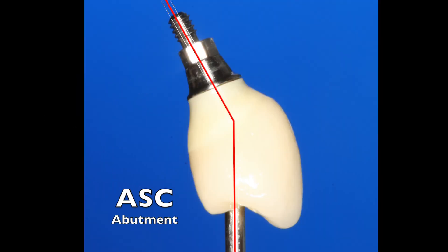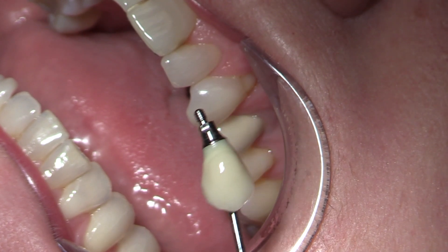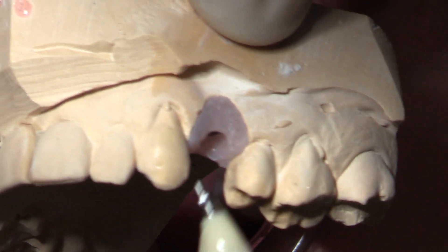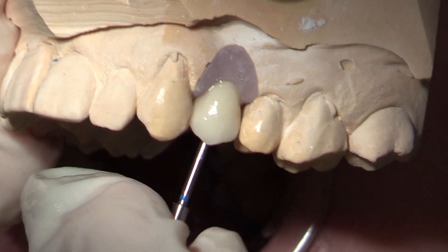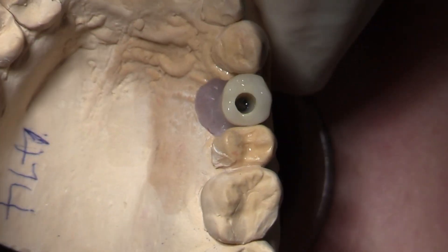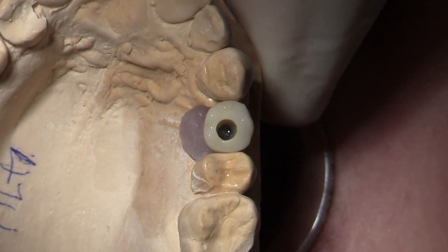After the porcelain is applied to the abutment, you can see the angulation we're able to achieve, allowing us to be screw-retained. We've also tipped it mesio-distally to create the ideal angle from that position as well. Taking this to the model and applying it into the soft tissue model area, you'll see it slides in quite nicely and allows us to get it into a position of idealized dentistry. Looking inside, you'll see the OmniGrip screw — the blue screw — which has a smooth aspect with a thread on the end. Looking over the occlusal aspect, we can see that the channel is now idealized.